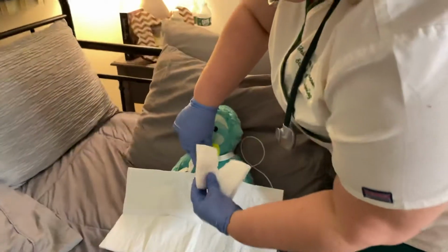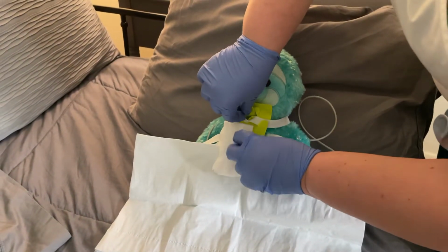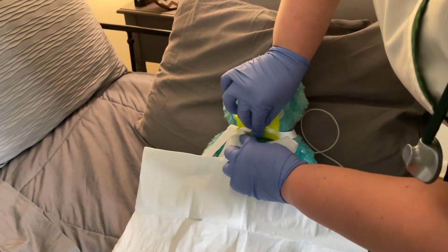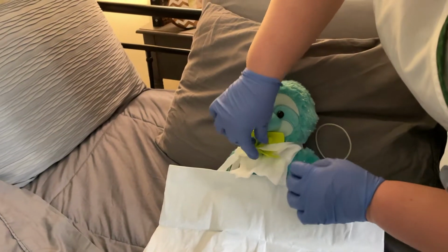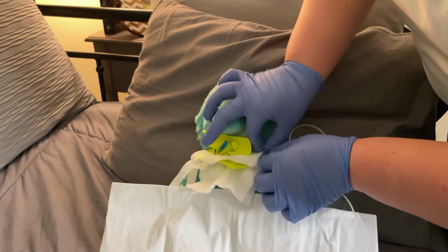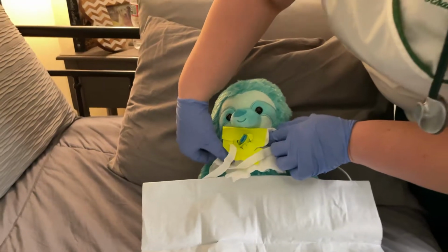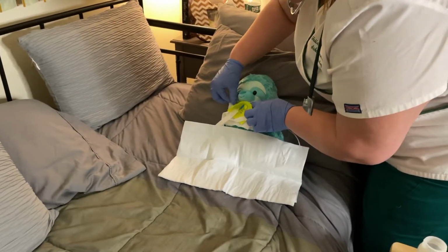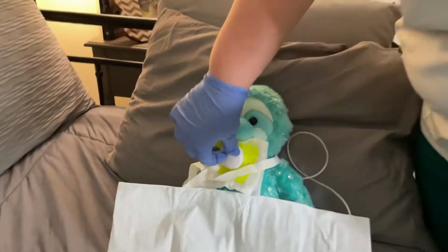We're going to remove the oxygen and we're just going to place it underneath, trying to maintain sterility as best we can. And once it's passed underneath the trach collar, both our hands will become clean and we can just pull and make sure the dressing is under. Okay. Very good. We're going to want to put the oxygen mask back on the patient.